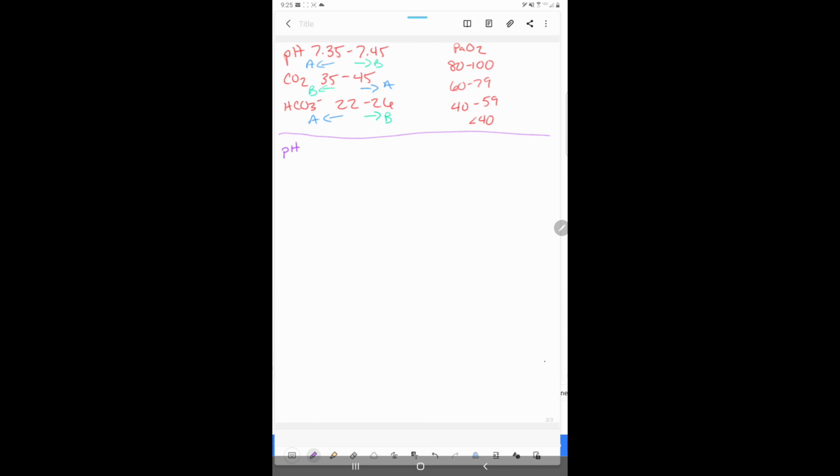So now you have a pH of 7.37, a CO2 of 69, and then you have a bicarb of 25, and then you have your PaO2 of 58.